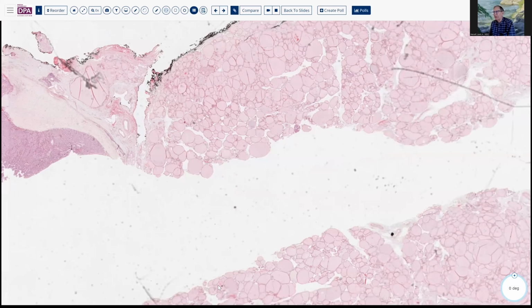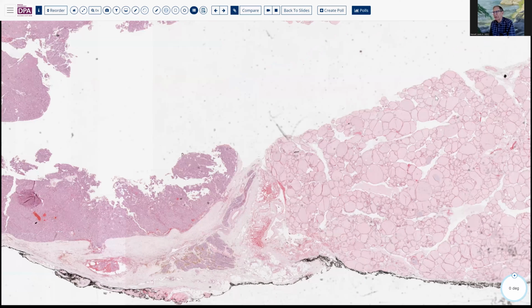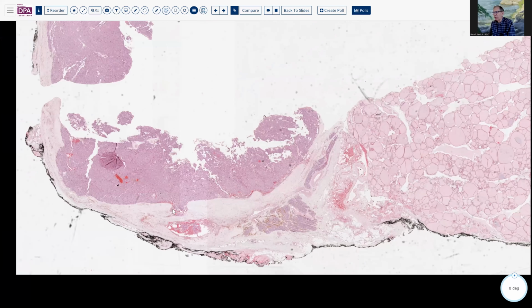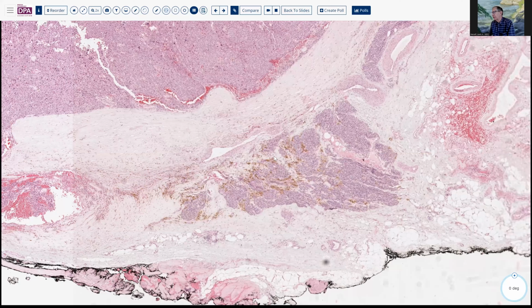Now, of course, many times the parathyroids may be actually intraparenchymal within the thyroid, and so identifying that could be difficult. Again, here's another area where we have certainly capsular invasion and probably capsular penetration. That could be a clue to then look for additional findings. Here's some hemosiderin outside here associated with some lymphoid inflammation.